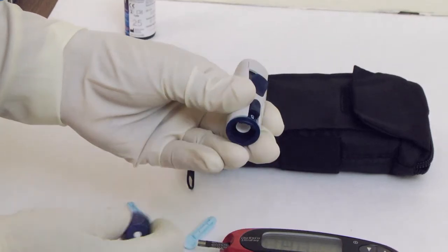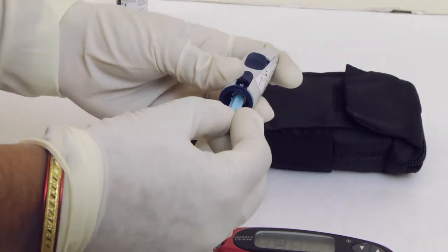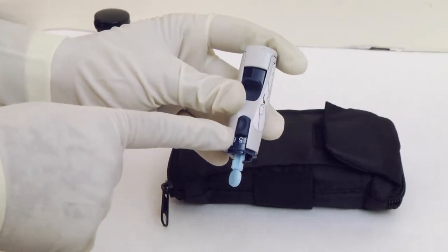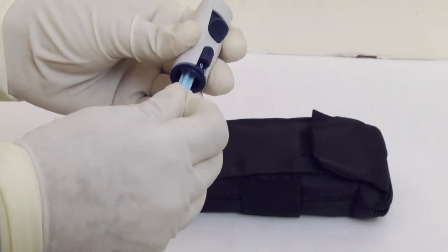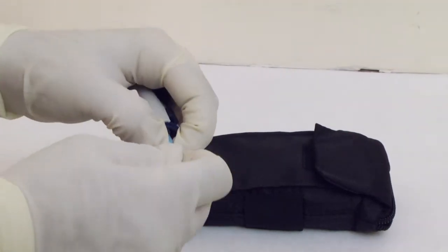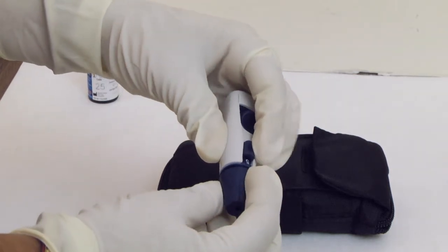Remove the blue cap of the lancet by snapping it off. Insert a sterile lancet into the lancing device. Insert the lancet into the holder and push in firmly. Twist the protective disc until it separates from the lancet, and save the disc for later use. Do not twist the lancet. Replace the blue cap by snapping it back on.